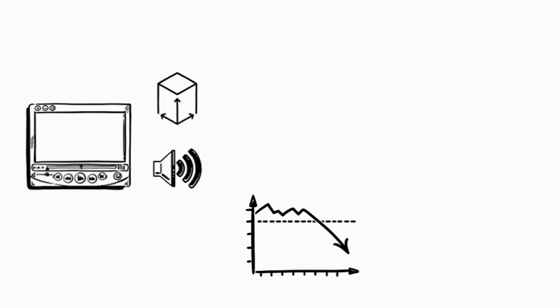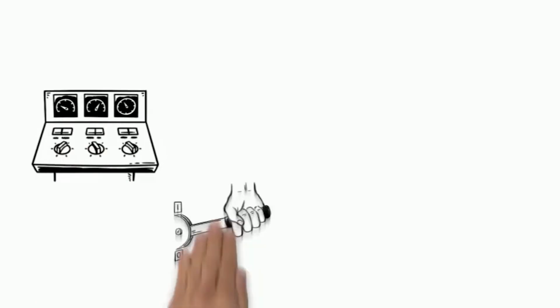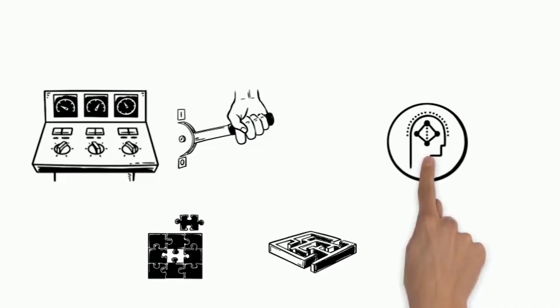Strengthening of a specific brain activity will therefore be rewarded. The brain is trying to self-regulate in which condition the screen is getting bigger. The training parameters are permanently monitored and individually changed if needed to take care that the training is never too easy or too difficult. This is done by adjusting the threshold of brain activity. First noticeable effects of the neurofeedback training appear after 5 to 7 sessions. In a neurofeedback therapy, 15 to 20 sessions should take place.